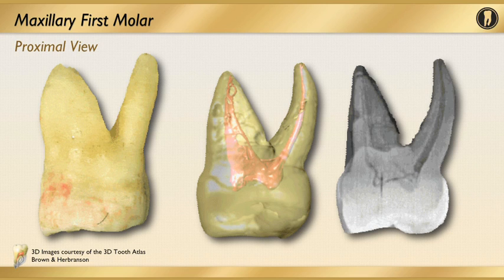That's there 85% of the time apically in the palatal root canal systems. And again, this is confirmed radiographically in 3 dimensions, all that we discussed: the complexities of anatomy, the presence of an extra canal in the mesiobuccal root, and the apical curvature in the palatal root.